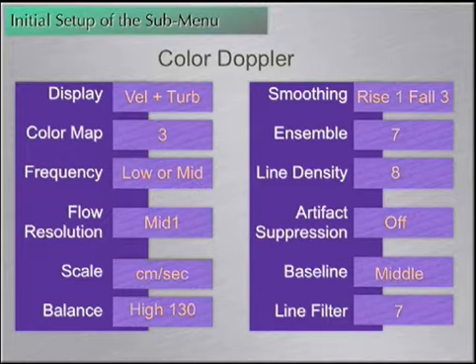Ensemble, 7. Line density, 8. Artifact suppression, off. Baseline, middle. Line filter, 7.